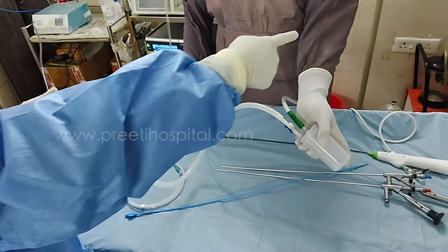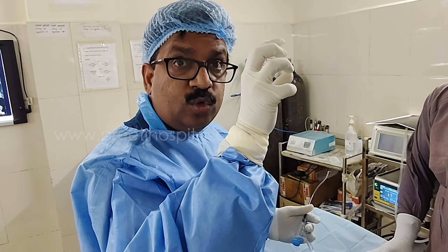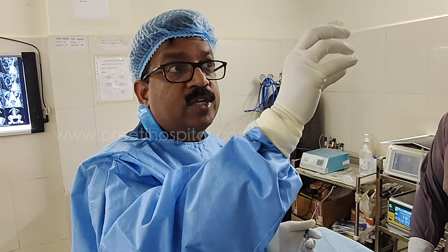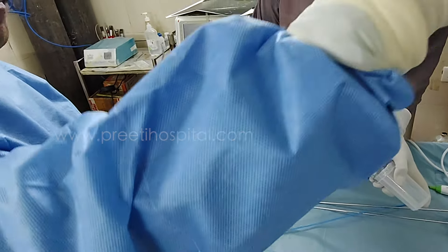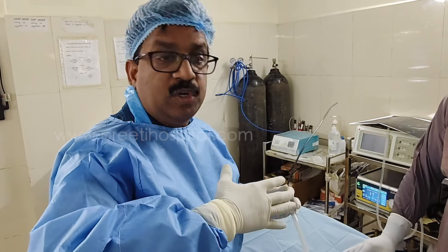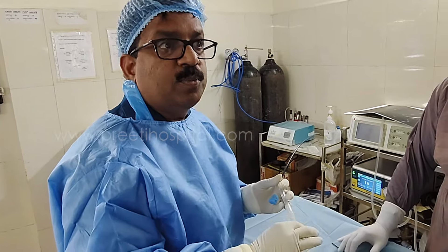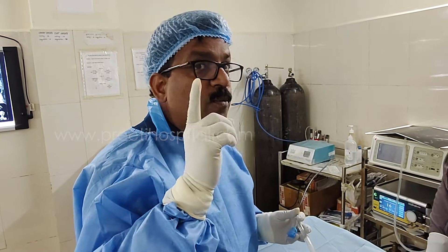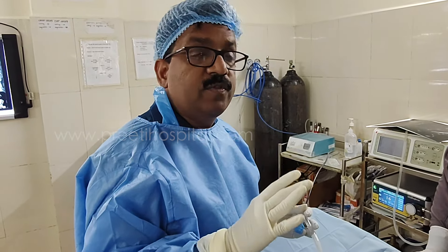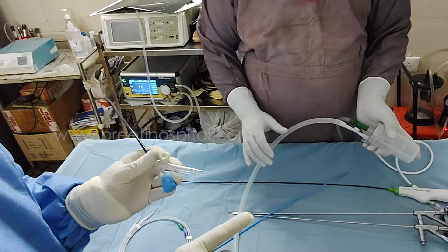Outflow monitoring is not easy — you have to monitor there. If you have flushed, how much has been flushed and how much is coming here, we don't know. The only way is to look: if the mucosa is coming nearer to the flexible scope, your pressure is not high. If it is going away, distending, it is not good. If you stop sucking and somebody infuses saline — dangerous, it will distend the kidney to rupture. That's why manual aspiration is better, or fixed low suction with manual slow infusion. If you use a pump, it is very, very dangerous.